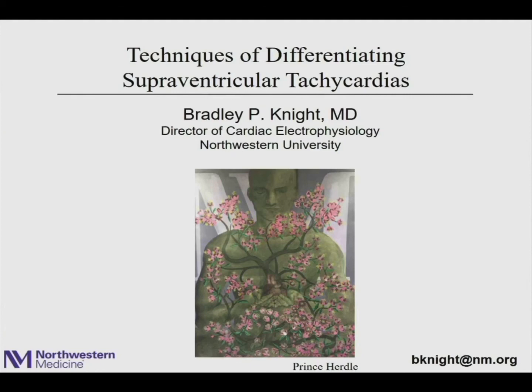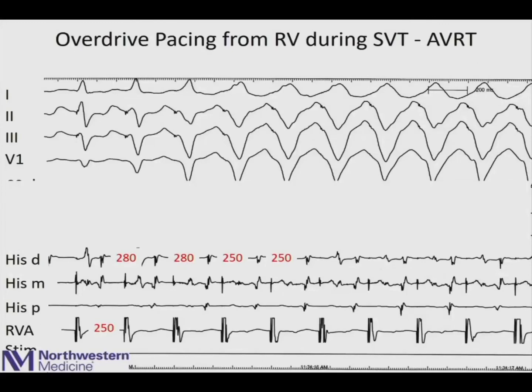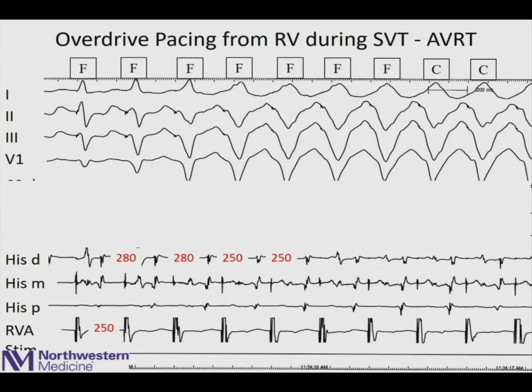Can you just go back one slide? There were several questions about that concept of fusion. First of all, I wanted to clarify there are some scenarios in EP where we use the same term to mean two different things. One of those is the term linking, which means different things in different contexts, and progressive fusion also. So when you say progressive fusion now, that's very different from the Al Waldo entrainment criterion progressive fusion with different pacing rates.